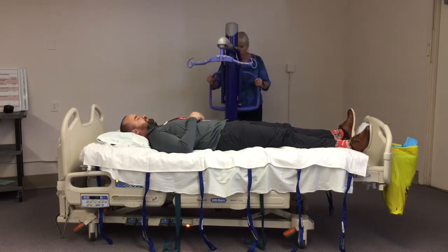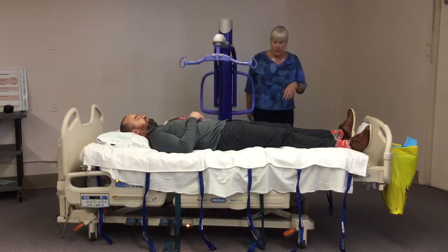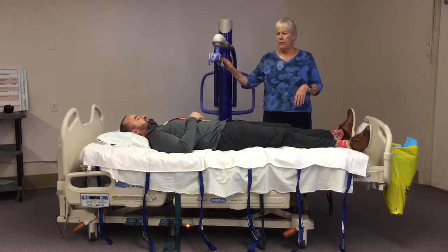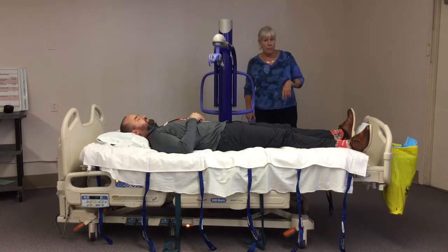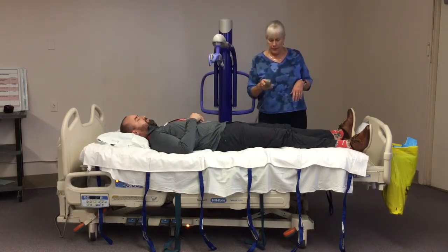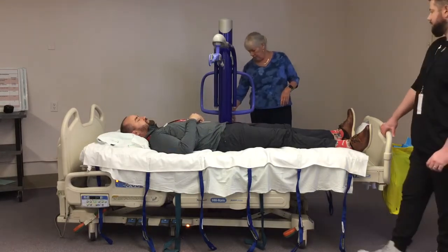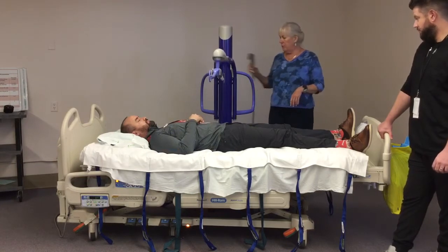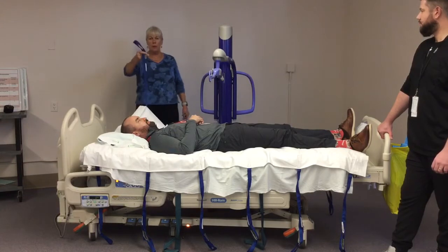So now I'm going to lift my patient up. So I turn my spreader bar perpendicular to the patient. Now I'm going to have a second caregiver that's going to help me with this. We're going to lower this down, and we're going to attach these loops to these 2-point spreader bar.